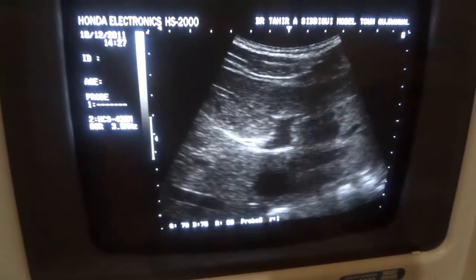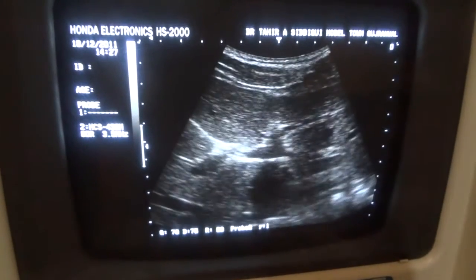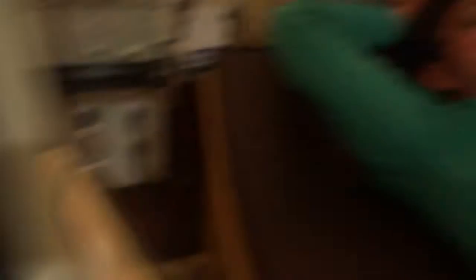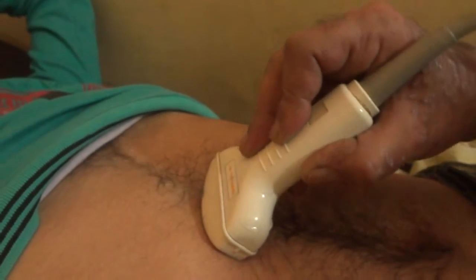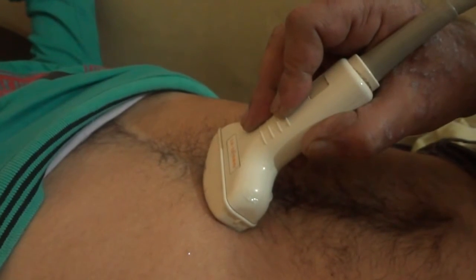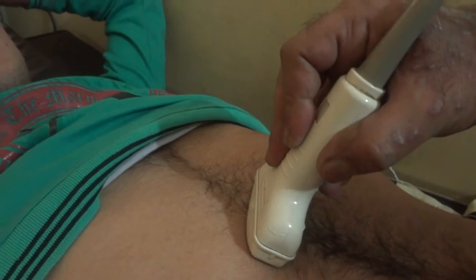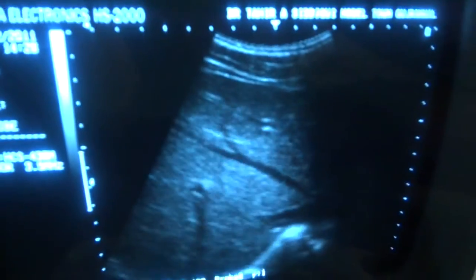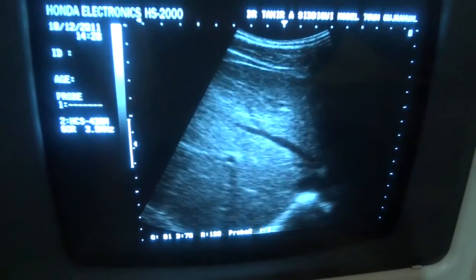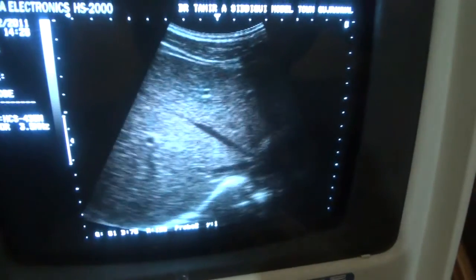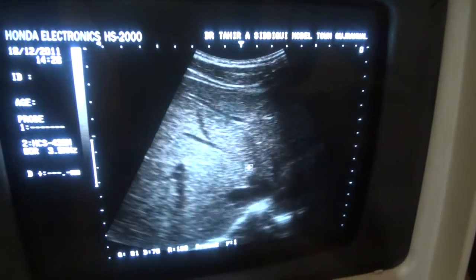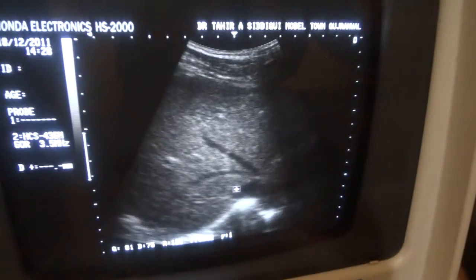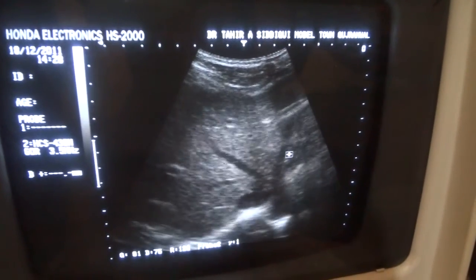At times we have to ask the patient to take a deep breath and hold it there. Now if I angle the probe more cephaloid — keeping the probe in the epigastric region, angling it to a 30-degree angle and moving it upwards — I can see the hepatic veins emanating from the heart. This is the middle hepatic vein, this is the right hepatic vein, and this is the left hepatic vein.